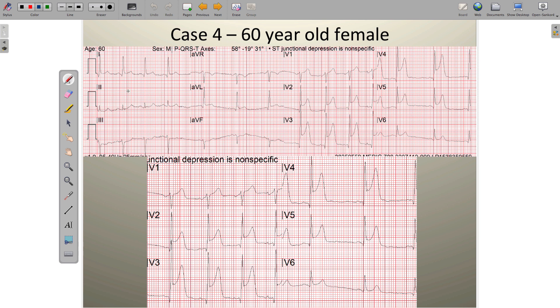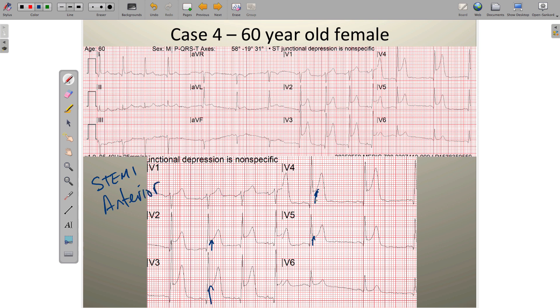Case 4: A quick glance reveals problems in leads V2 through V5–V6. This is a female patient, so only 1.5 mm is required in V2 and V3. Lead V3 has 6–7 mm and V2 has 3–4 mm — well above threshold — continuing through V4 and a little in V5. This is anterior wall STEMI. Looking at the reciprocal inferior leads, subtle ST-segment depression is present, confirming reciprocal change.